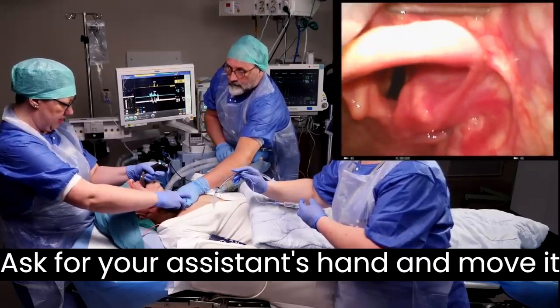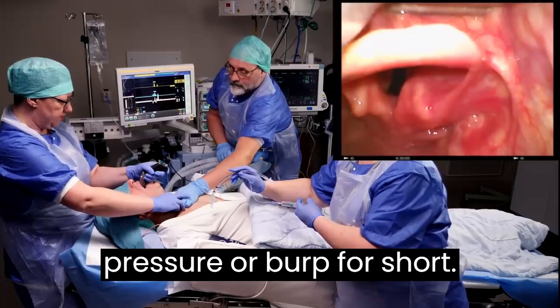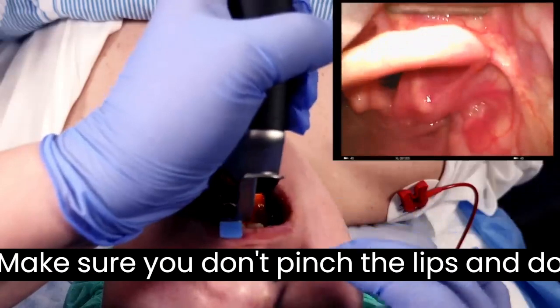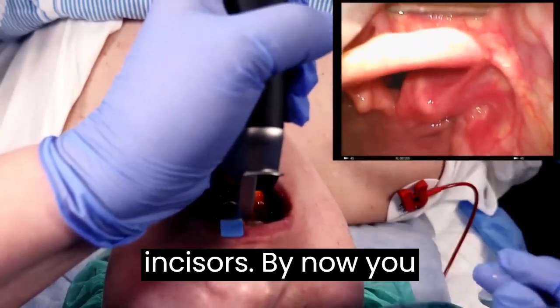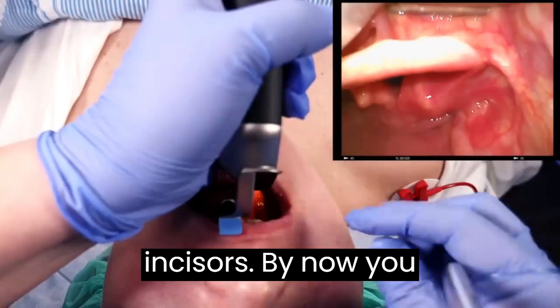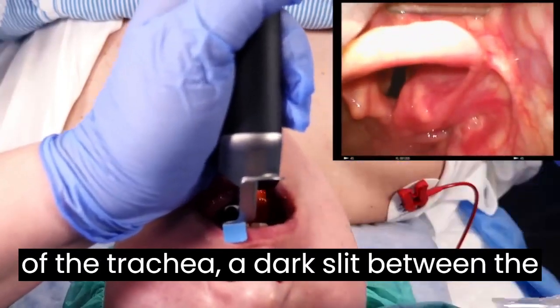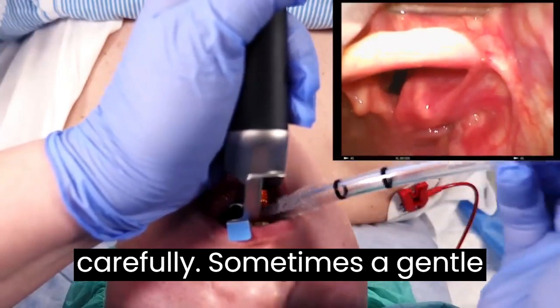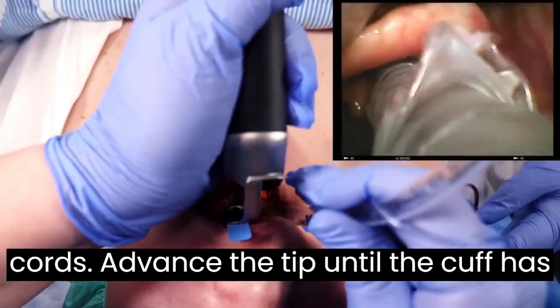Ask for your assistant's hand and move it to apply backwards, upwards, rightward pressure, or BURP for short. Make sure you don't pinch the lips and do not exert any pressure on the front incisors. By now you hopefully have a clear view of the opening of the trachea, a dark slit between the pale vocal cords. Insert the tube carefully. Sometimes a gentle rotation is required to pass the vocal cords.